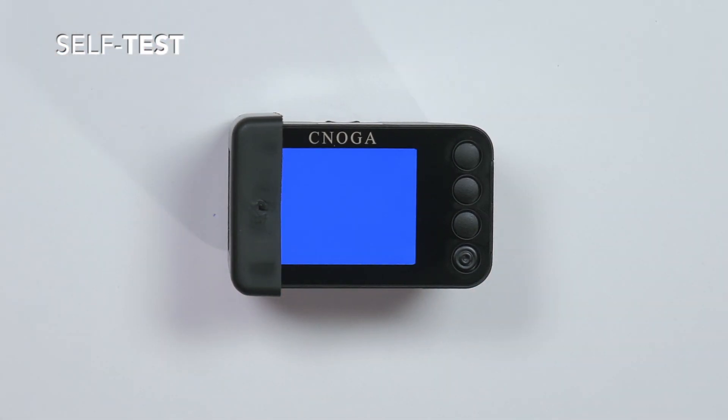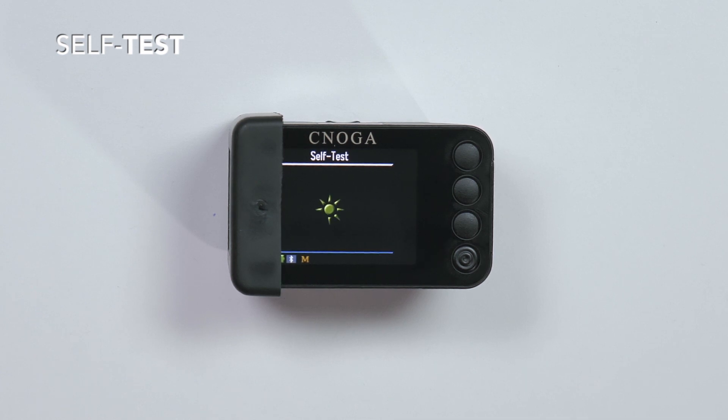The screen shall change colors and a self-test process shall begin until the following message appears: Self-test successful.